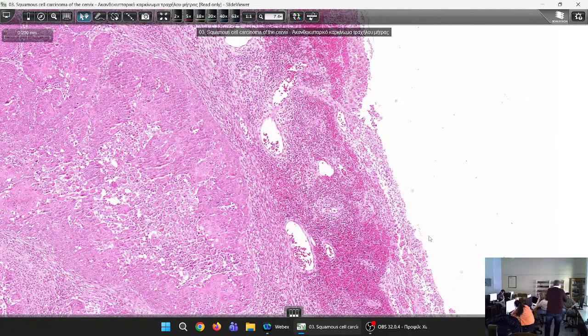So you have to tell what's the cause of the ulceration. That's why you take biopsies, and you look at them under the microscope. If you see malignant cells, you say it's cancer. Cancer has caused the ulceration. If you just see the inflammatory exudate, it's some sort of ulcerative cervicitis, inflammation of the cervix.